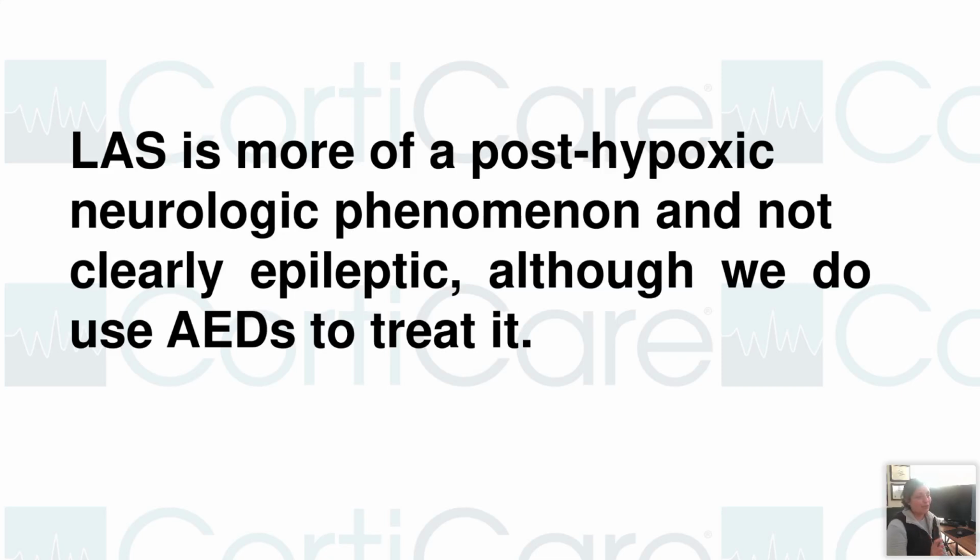So that's the biggest difference between myoclonus status epilepticus, or acute myoclonus, versus chronic myoclonus, which is Lance-Adams syndrome. Acute myoclonus is purely epileptic, and what we are seeing here is not epileptic. Those are the neurons behaving this way due to the hypoxic insult, due to cardiac arrest.